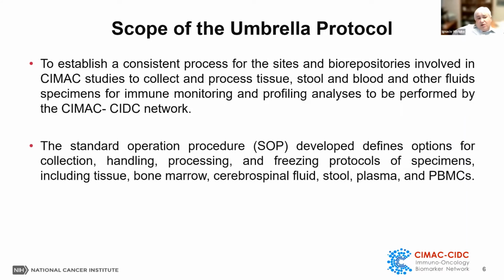We also developed standard operating procedures, SOPs, that define options for collection, handling, processing, and freezing protocol of specimens, including, as I mentioned, different specimens. It's important to say that these protocols have different options sometimes to accommodate the reality of clinical research. And the focus is to have the right sample for the right assay, minimizing pre-analytical variables.